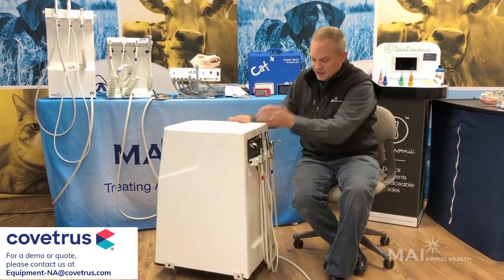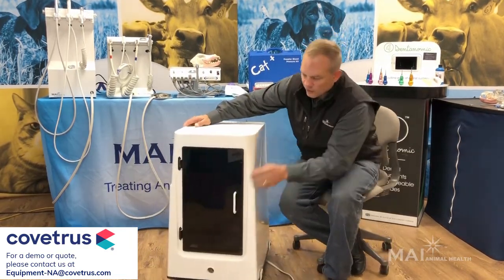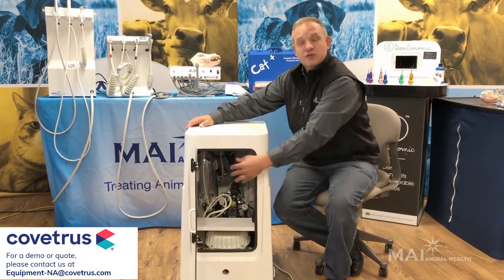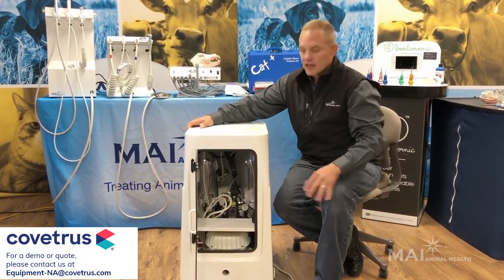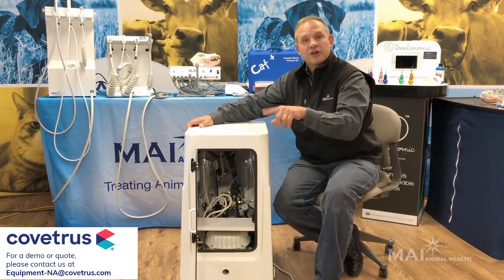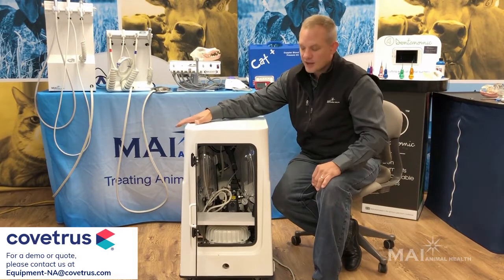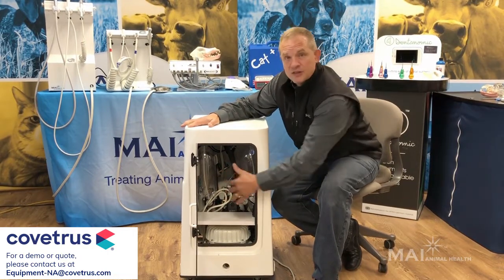On the back side of the dental unit, there is a door, and that's where you replace or put your waters. It has two liter bottles that you can toggle back and forth, turn the water on and off. Of course, you can adjust the flow of water to your hand pieces. And then your compressor as well.